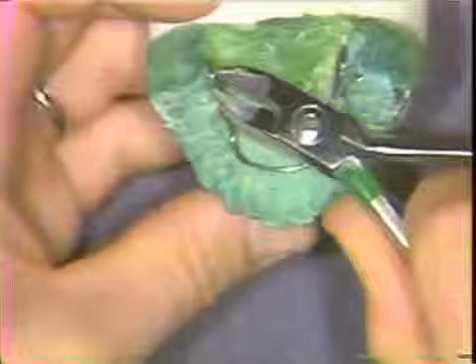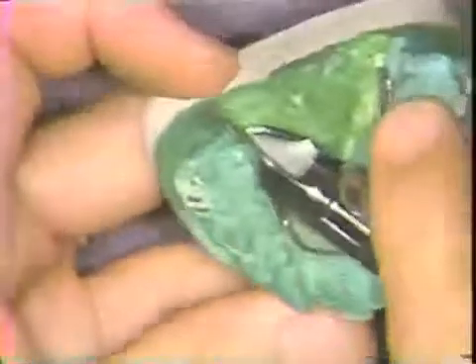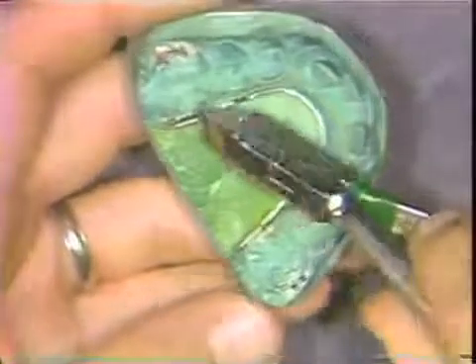It's generally inserted with a ligature cutter drawn from the distal towards the mesial. It is checked to make sure that it is perfectly passive and lying in close proximity to the lingual sheath.